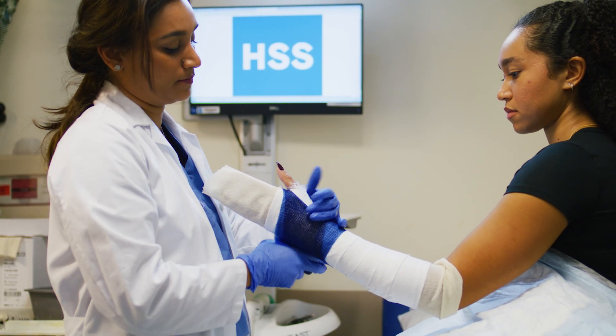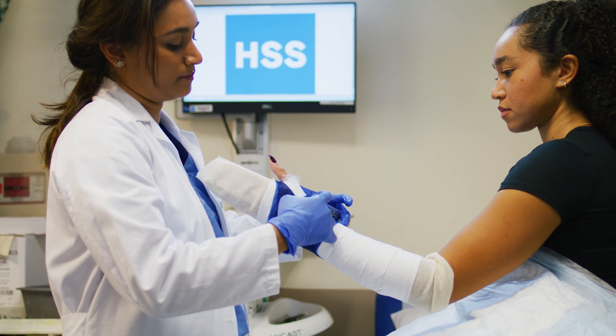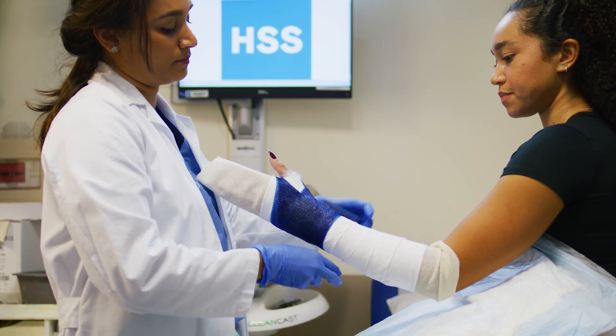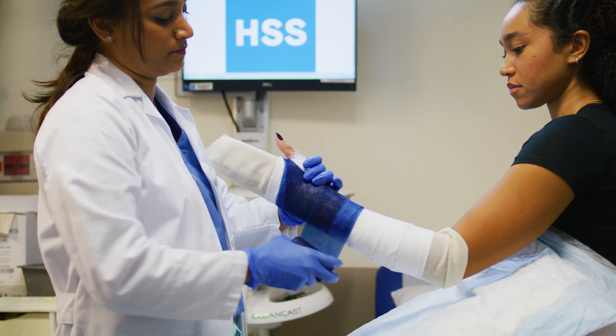A cast will be custom fit to the injured area, providing the best possible support, usually including the joint above or below a broken bone. Your doctor will determine if a waterproof cast is appropriate.